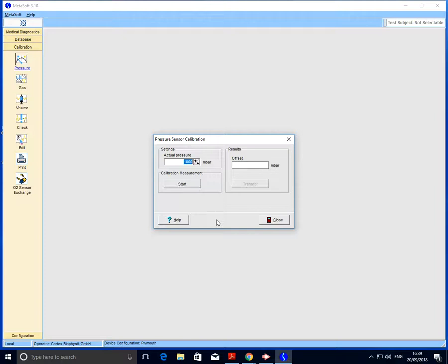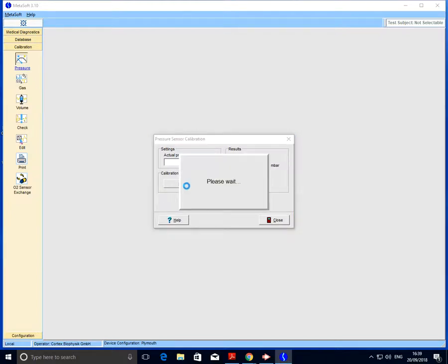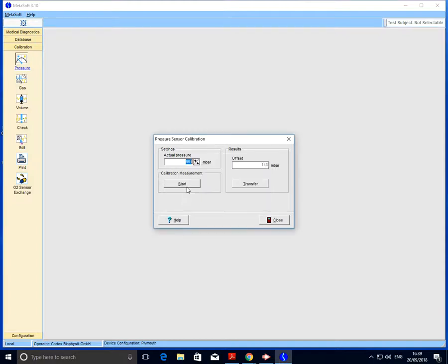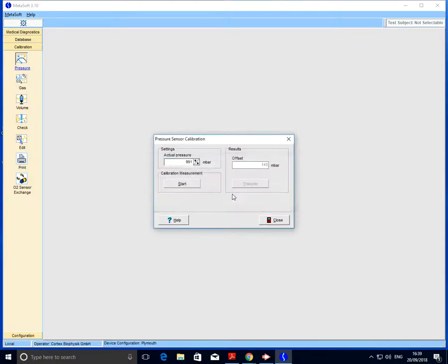On top of the Cortex stand we should have a digital barometer, and along the bottom of the display we should have a reading in millibar. For example, the pressure in the lab today is reading 991 millibar. We enter the actual pressure and then click start. Once that's registered, we then hit transfer, okay, and close.